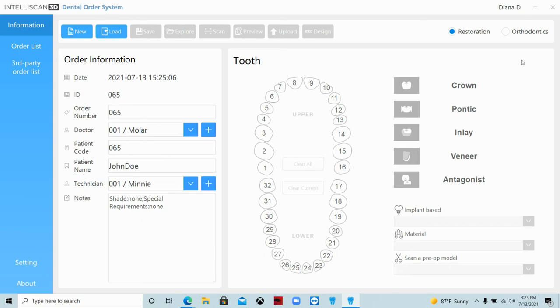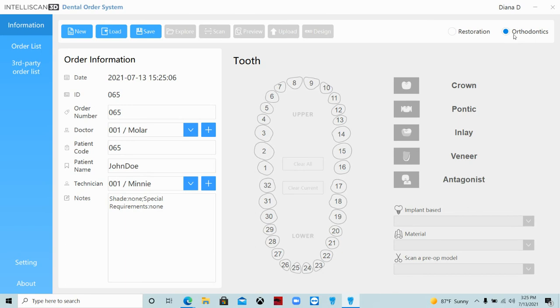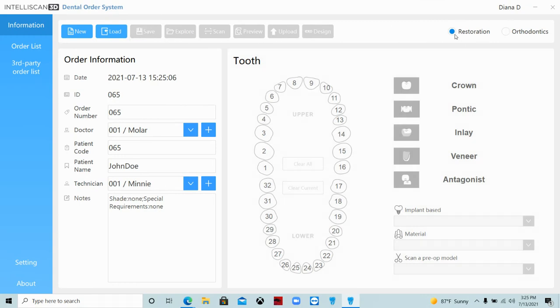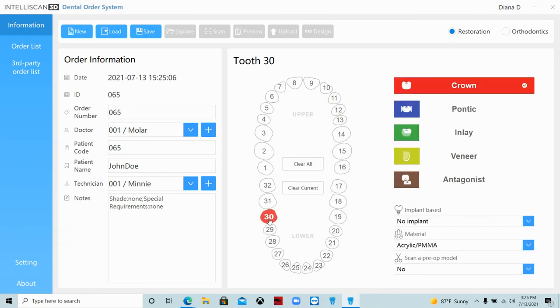And then in the upper right-hand corner, you see restorations or orthodontics. If it's anything that does not include a restoration, you simply click the orthodontics tab and then you're finished. You can hit the save button at the top of the screen. If it's a restoration, click restoration.